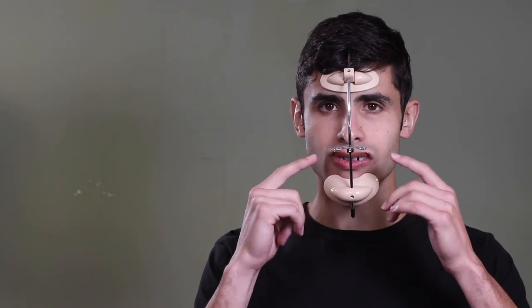It's a very simple device. It's just got a pad on the forehead, a pad on the chin, and it's got two hooks here to attach regular orthodontic elastics, and then those elastics attach to the hooks that are coming off of the MSE.